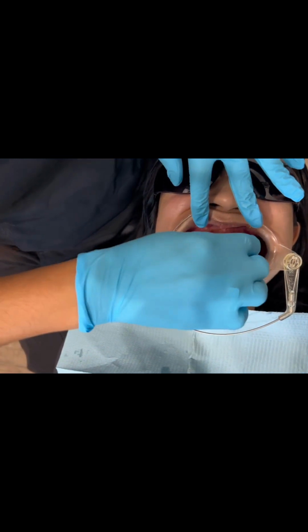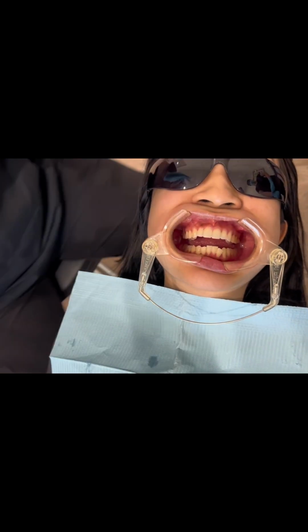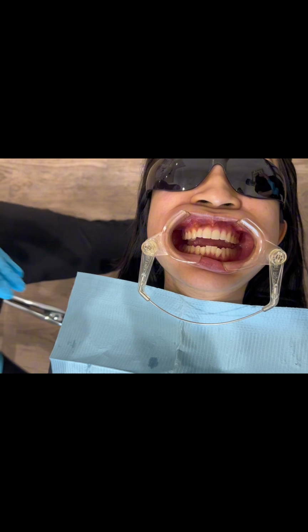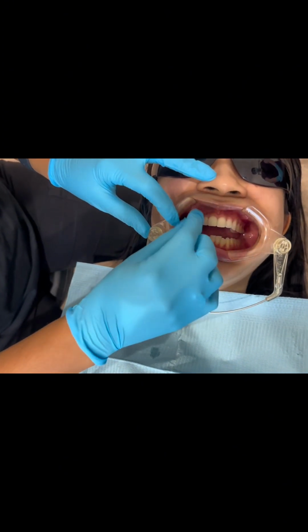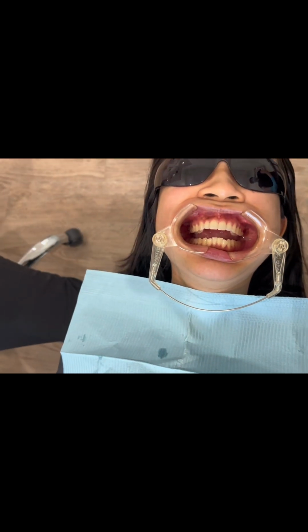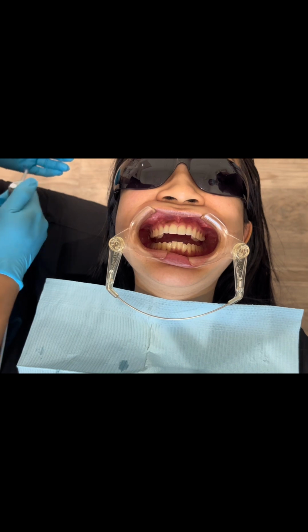Now usually we would go from molar to molar, prepping the brackets for the doctor. But for this specific case, the doctor just wants me to prep from premolar to premolar, so that's what I'm gonna do. But usually for most orthodontists, you'll be prepping from molar to molar, okay?